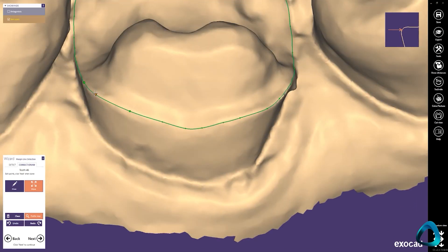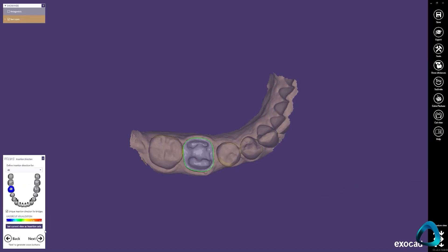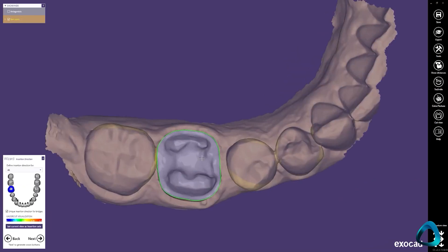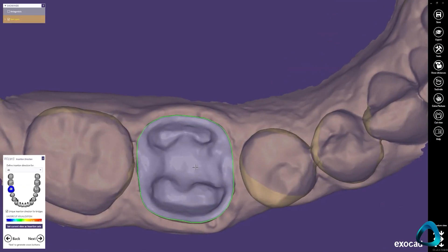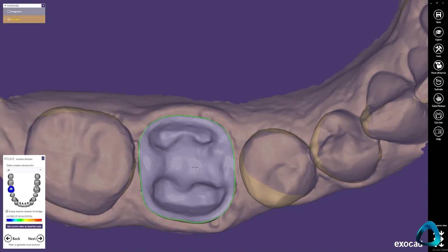The next step is insertion direction. In this part of the workflow, we will tell the software where the insertion direction of the restoration is. For a single crown, this is very simple and most of the time you simply set it at the occlusal point of view. What you want to keep an eye out for is ensuring that the adjacent teeth do not obscure the margin line from your selected path of insertion, and you also want to try and minimize or avoid undercuts as much as possible at the same time.